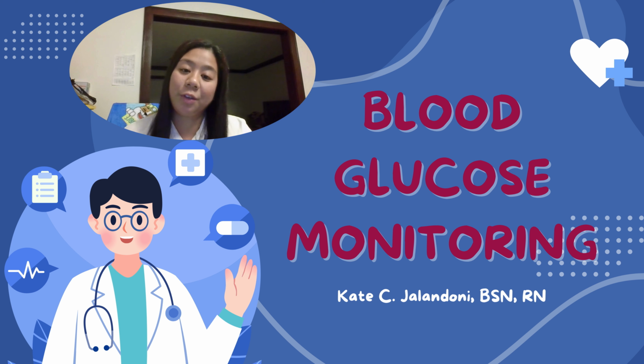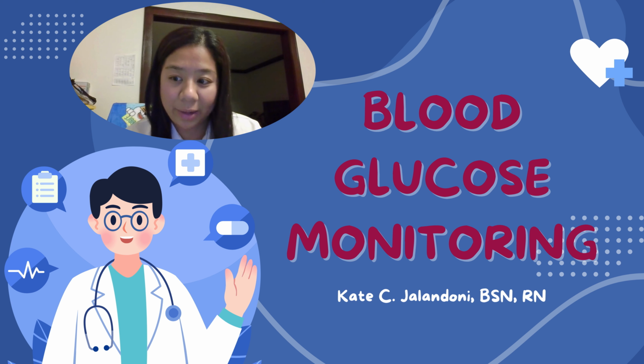Today we will be learning and discussing blood glucose monitoring. For this specific training, I will provide a direct demonstration and I will be your instructor. I will perform the entire procedure step by step while you observe. All right? I will use this teaching method so that we are able to appropriately and correctly operate a glucometer and correctly perform blood glucose monitoring.